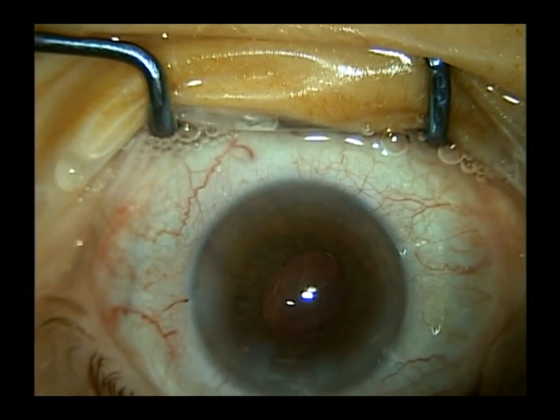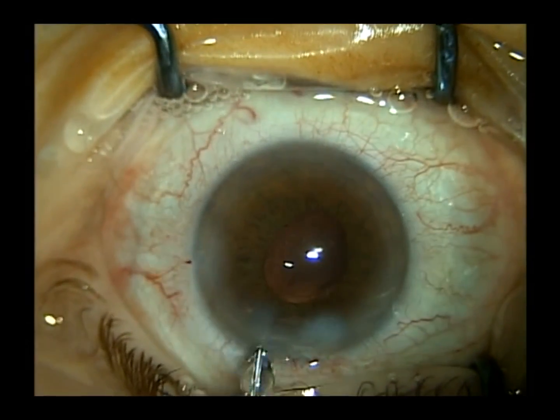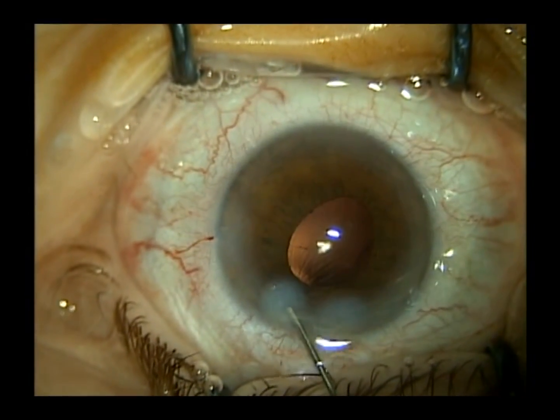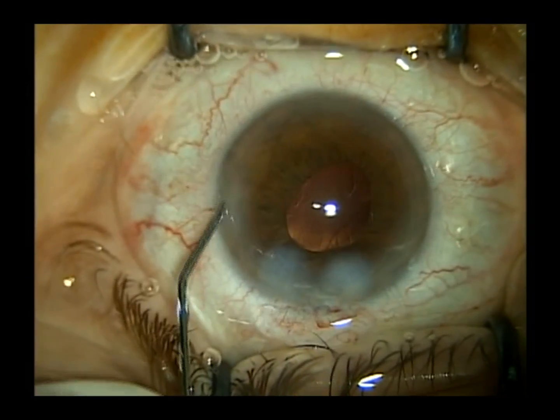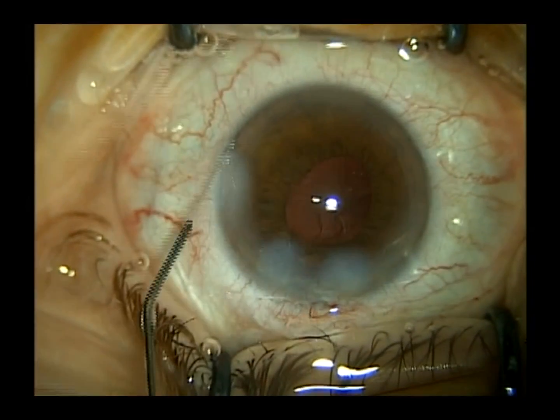We just stromal hydrate our incisions. The 2.8 millimeter incision that I made at 90 degrees usually will cause about 1 diopter flattening along that corneal meridian. That looks great.